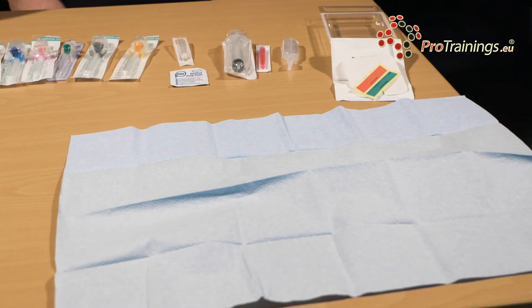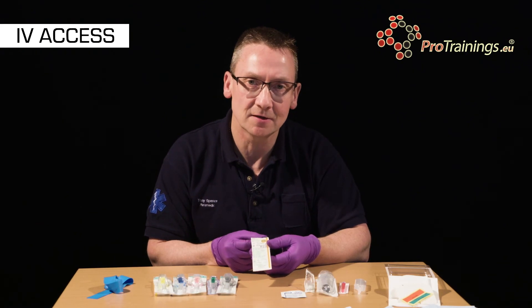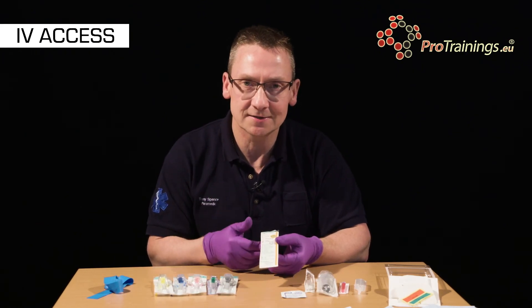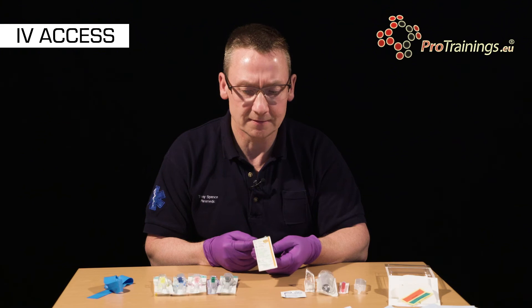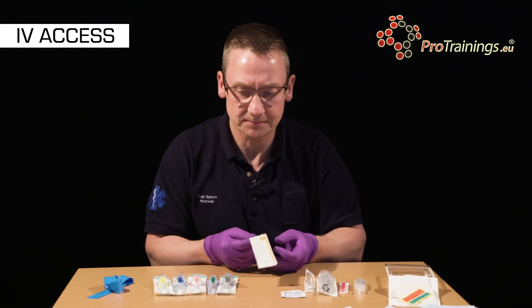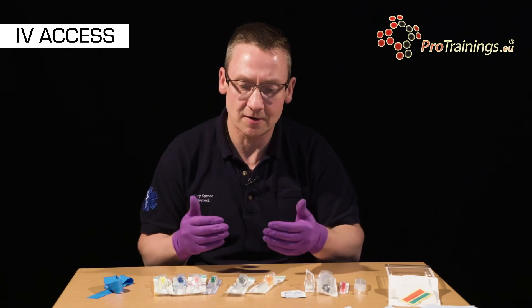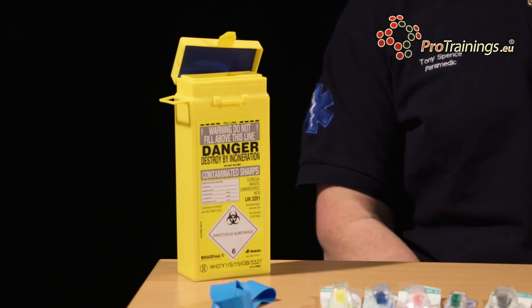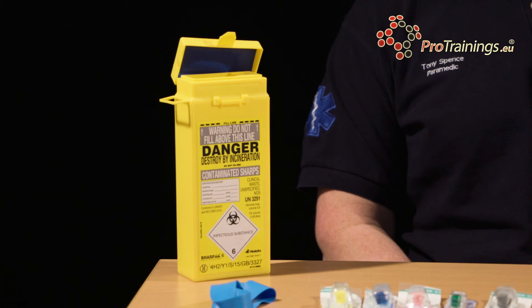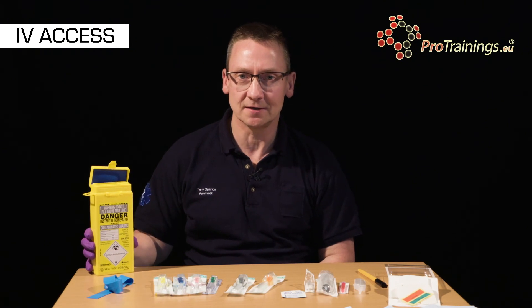As with all consumables they do come with a use-by date, and it's important that we don't use the product beyond that date as the sterility can no longer be guaranteed. They are irradiated when they are manufactured but that irradiation wears off after a while and the manufacturer can no longer guarantee the product. We should make sure that the packaging is not damaged and that there is no ingress of dirt and therefore potential bacteria into the packaging. Because a sharp will be exposed during this procedure, it's important to make sure that we always have a sharps container close.